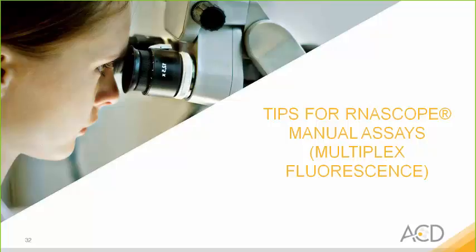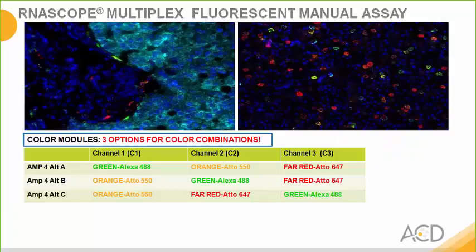Some tips for the manual assay on the multiplex fluorescent. Here we have the image of the multiplex assay. With the multiplex assay, there are 3 color module options available to provide for 3 options of color combinations.